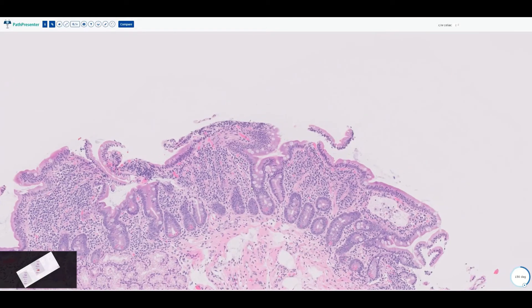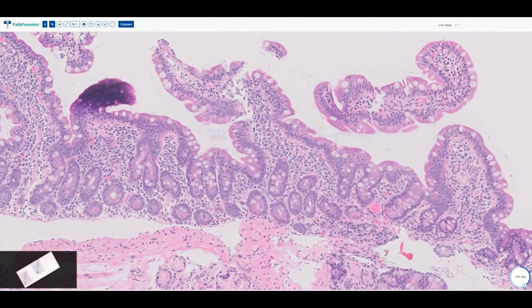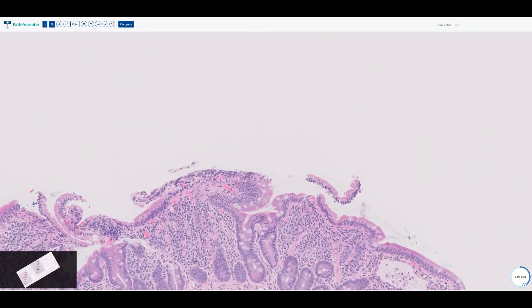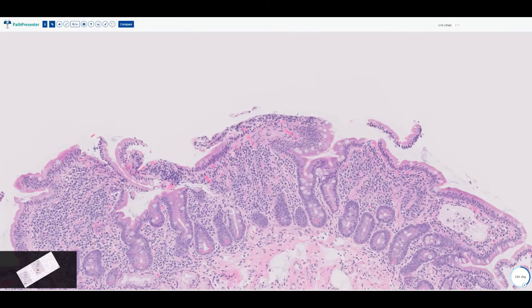When counting increased intraepithelial lymphocytes, there is one caveat: you do not count at the base of the crypts — you must count at the villus tip. If the mucosa is flat, you can estimate where the villus tips would be between crypts and count there. The threshold for increased IELs is greater than six lymphocytes per 20 epithelial cells at the villus tip. That said, most experienced pathologists won't formally count — they look at it, it's clearly increased, and they call it. With more experience comes more gestalt, and it's faster.